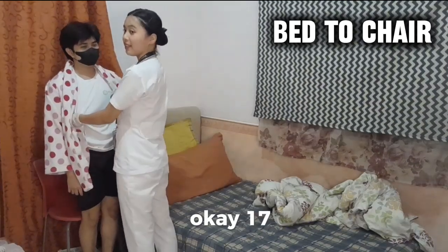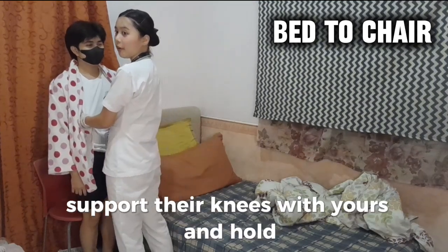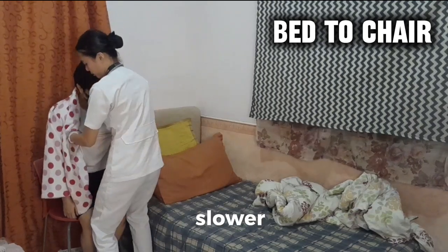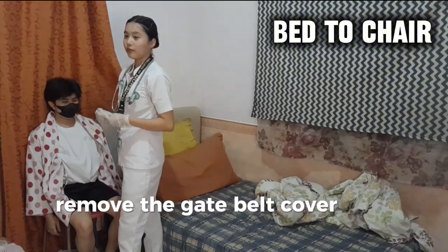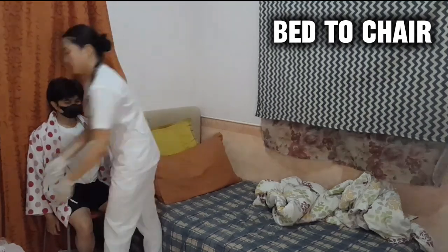Okay. Seventeen, ask the patient to sit slowly. Support their knees with yours and hold the gait belt. Bend your hips and knees to help them lower. Okay, 1, 2, 3, slower, slower. Okay. Eighteen, check if the patient is sitting properly. Remove the gait belt, cover them with a blanket, and place the call bell and important items within reach.